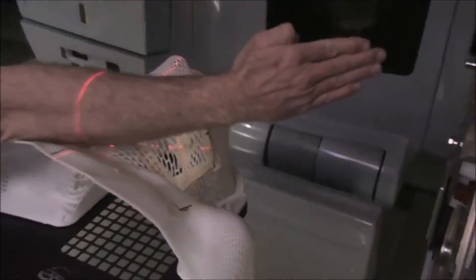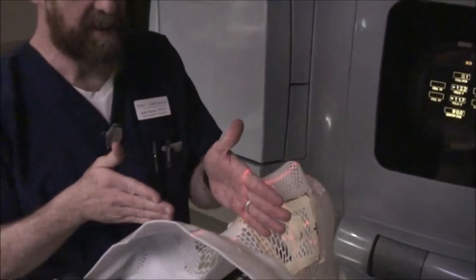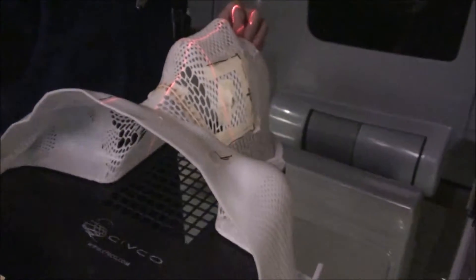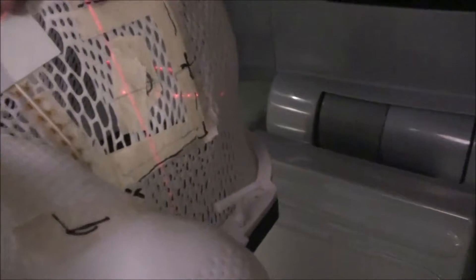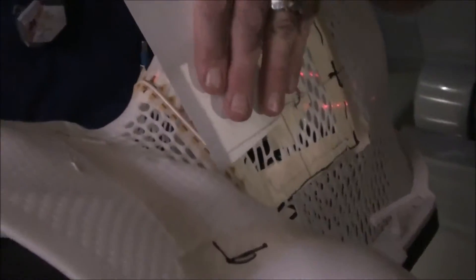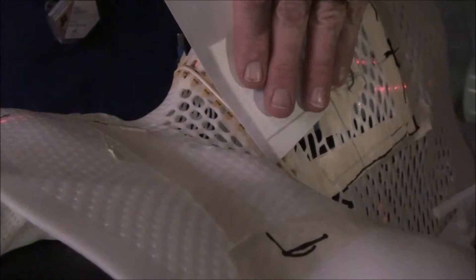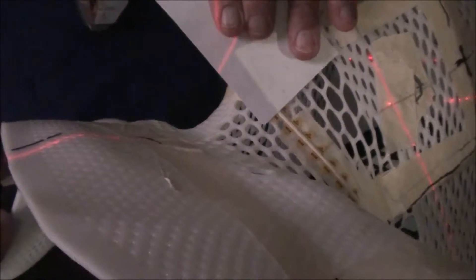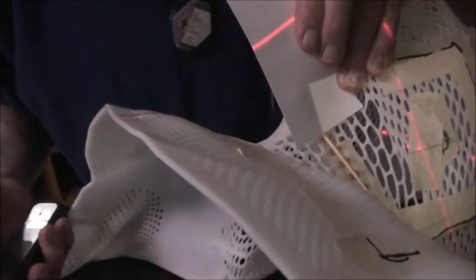What we have to do, since our divergence is thusly, is go ahead and kick the table so that this angle lies with this divergence. The table is actually going to kick feet toward the gantry. It's difficult to actually see exactly how that has to go. I'm going to over-exaggerate this — way posteriorly I'm matching, but anteriorly I am not. It's not much, but we've got a couple of millimeters of divergence that we have to take care of.